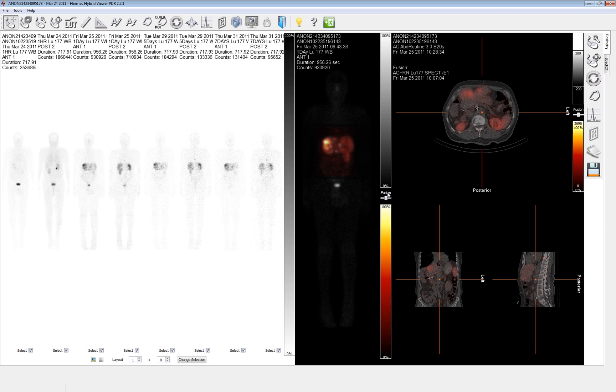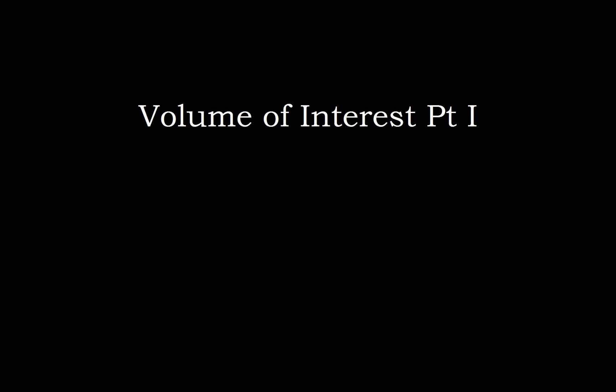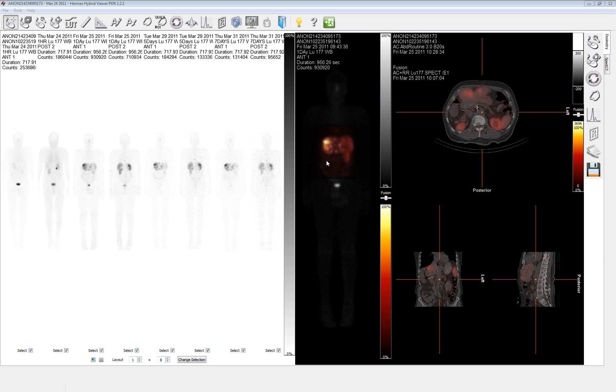After this, we'll move on to the VOI drawing. So after we have completed the alignment phase, the next step is to draw our volumes of interest in the SPECT CT. We begin with the volumes of interest because moving over to the whole body and drawing the regions of interest in that specifies that we are finalizing our SPECT CTs of those organs.